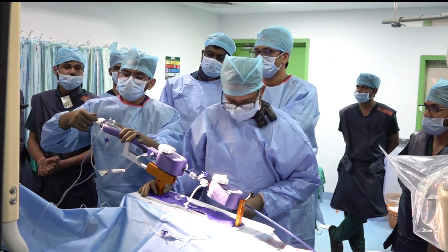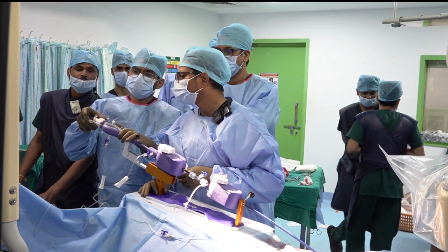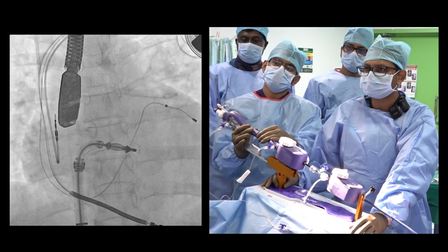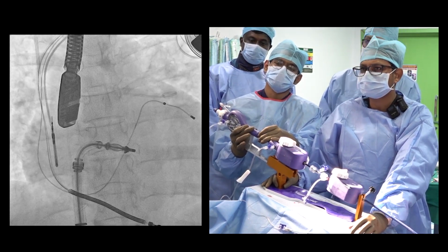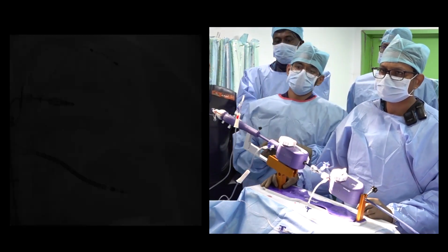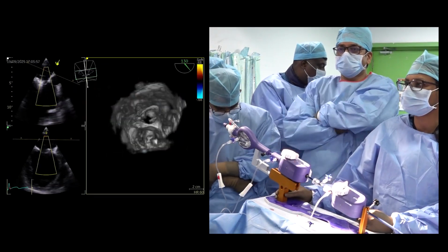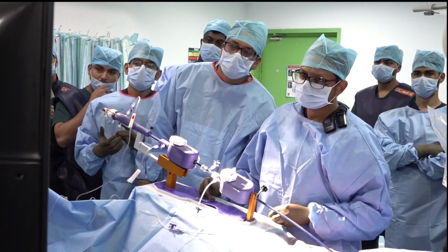Thank you, sir. You go to grasp. Unlock the clip. Open the clip. Ready? Can you place color on this? Yes. Hemant sir, we are opening the clip. Can you just check in 3D and fast? You want to see in the 3D? Yeah. We'll dive in, sir.